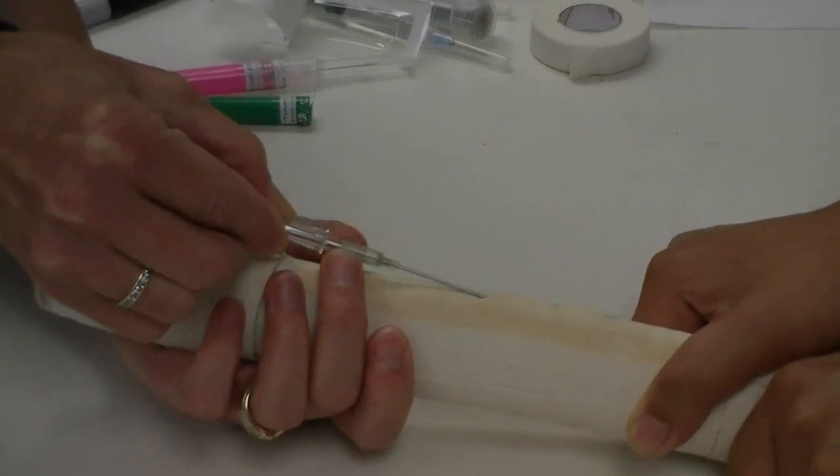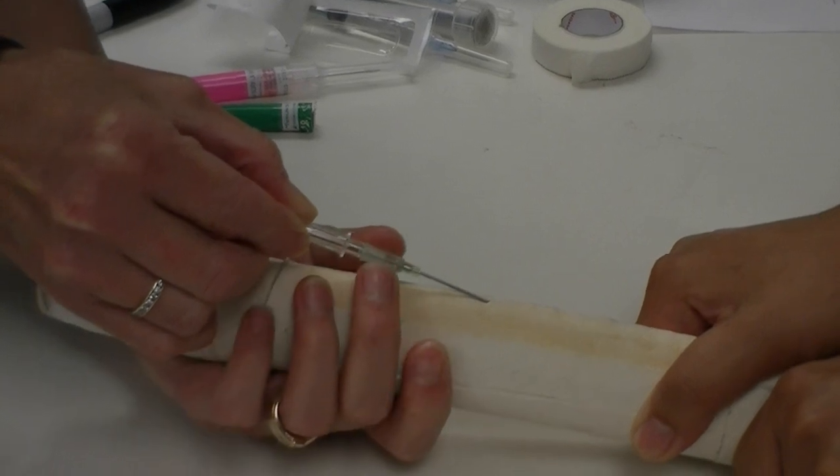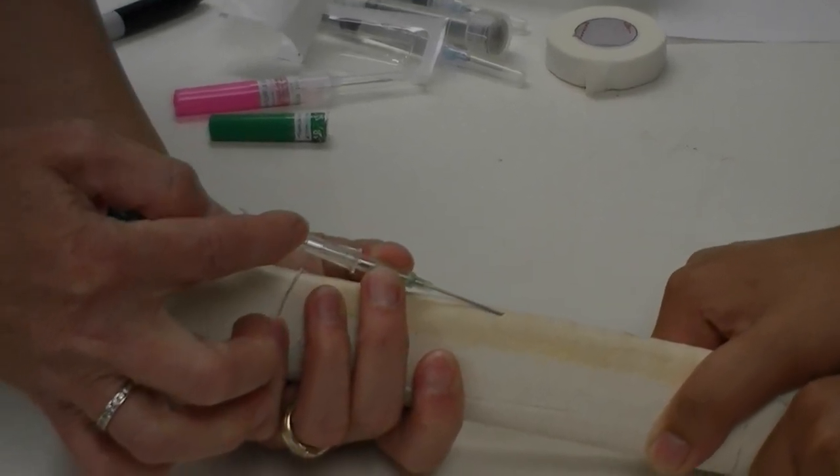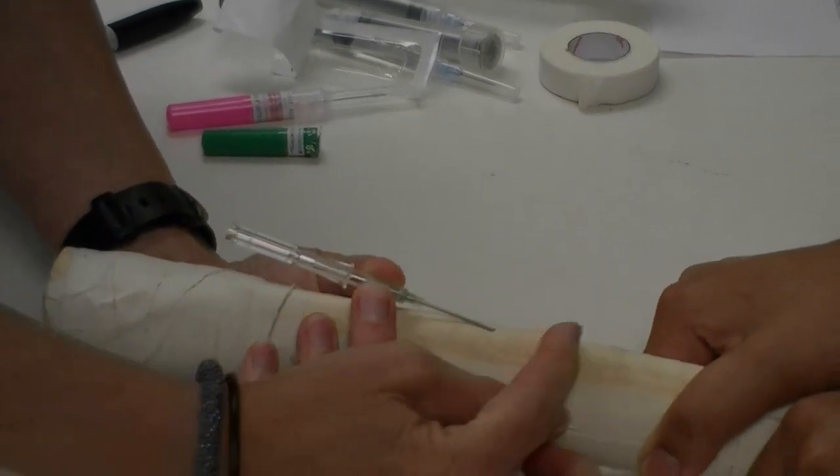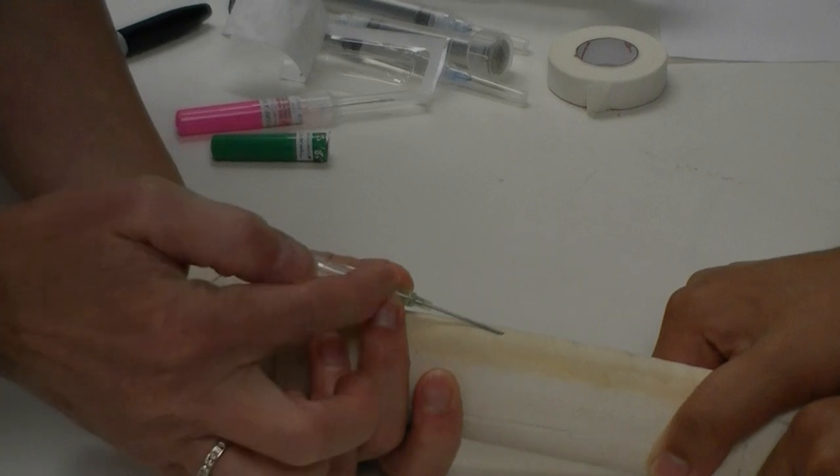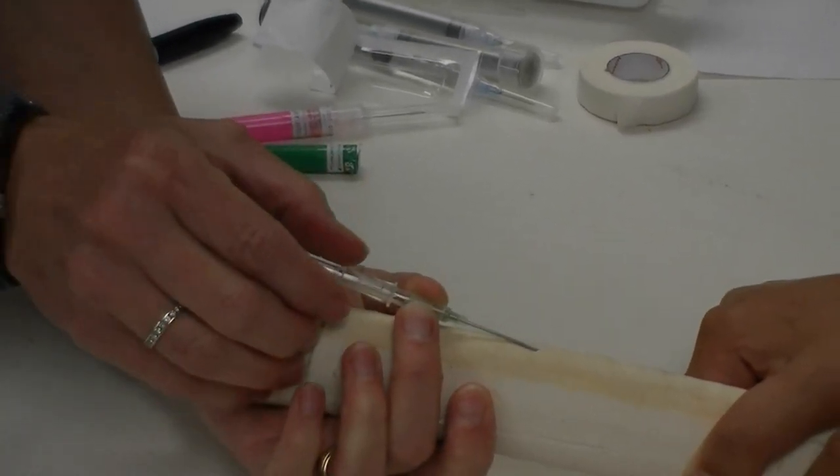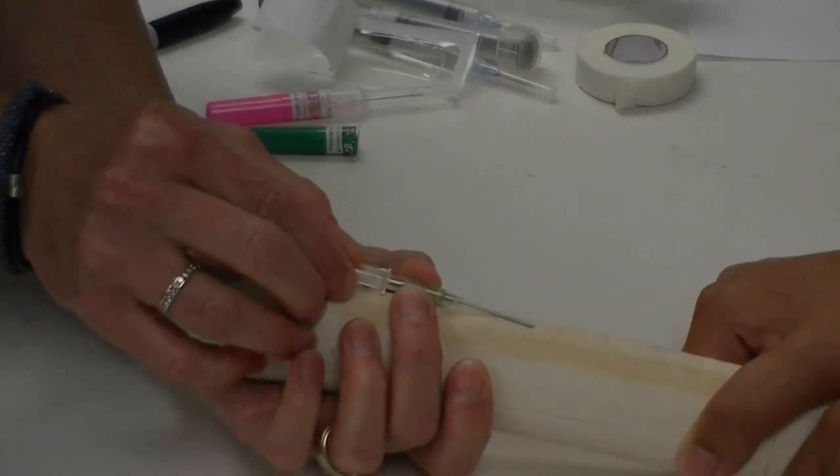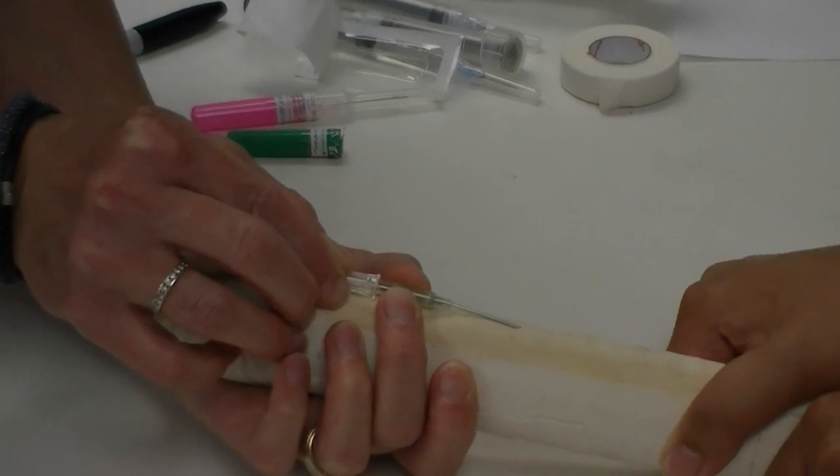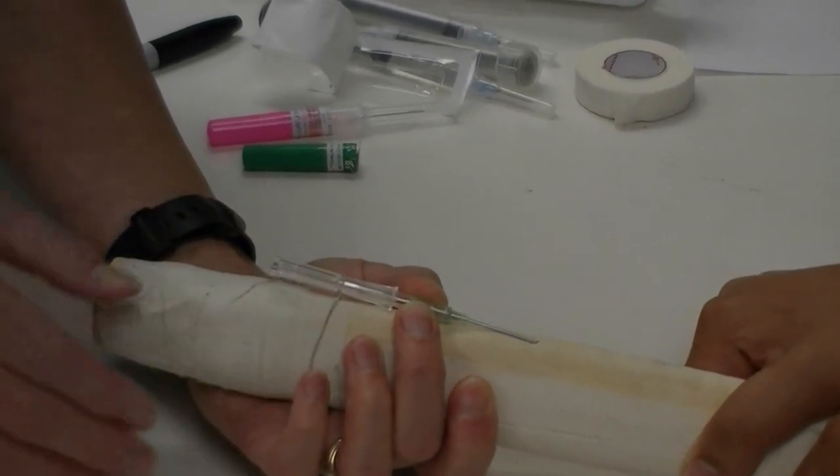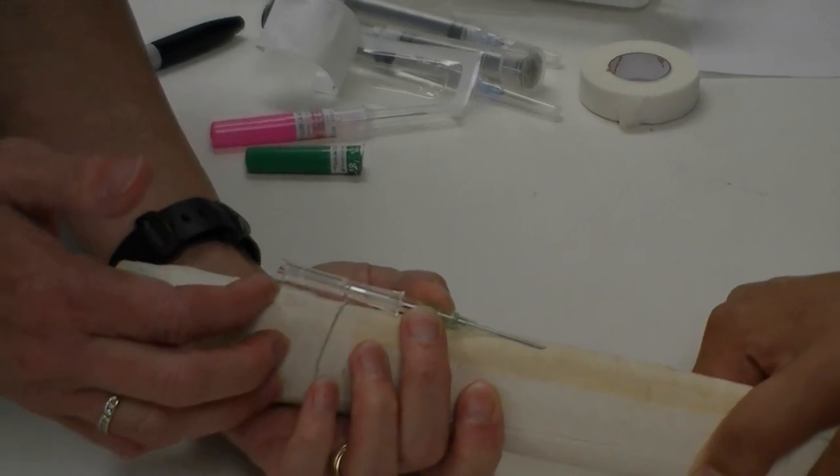This sometimes takes a little bit of pressure with thick-skinned patients. Once I see the flash of blood, I'm going to carefully advance both parts—both the catheter and the stylet—one or two millimeters further forward into the arm. If it's a large patient I could go several more millimeters than that. I'm continuing to see blood flowing into the end of my catheter portion here.